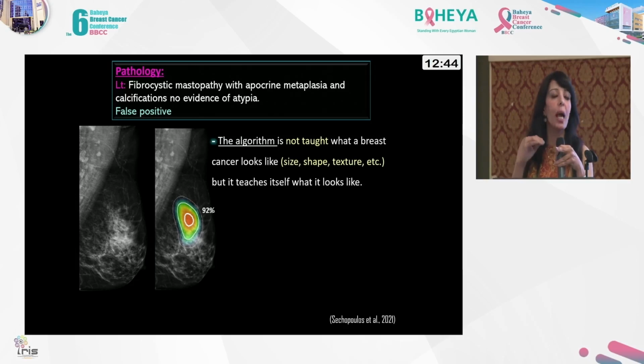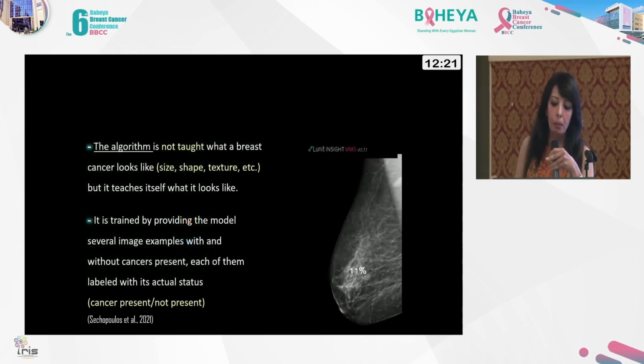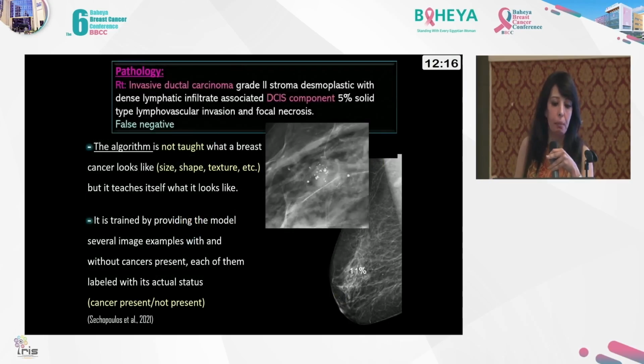No, it's fed with images. Cancer not cancer, cancer not cancer, and if it's not fed with this type of cancer هيحسب ان هو negative although it's a cancer. But for us we go with the morphology descriptors and build them over each other, and that's why sometimes we consider the lesion BI-RADS 4 for only one descriptor, although all the other descriptors go with the benign morphology. And sometimes when I'm having a cancer, it gives me an 11% for the same reason, in this case, which was case number 11.